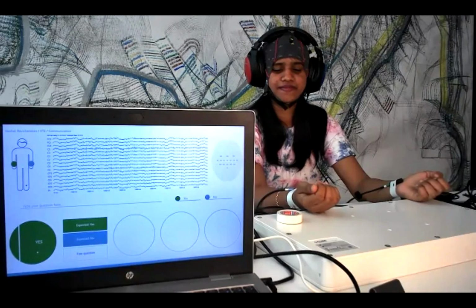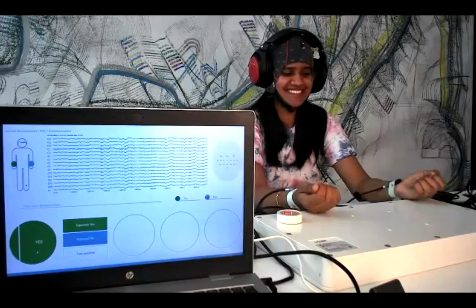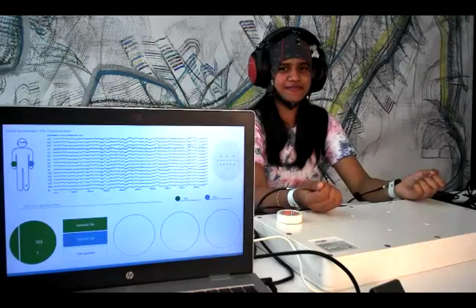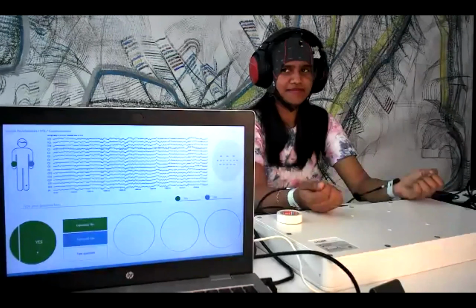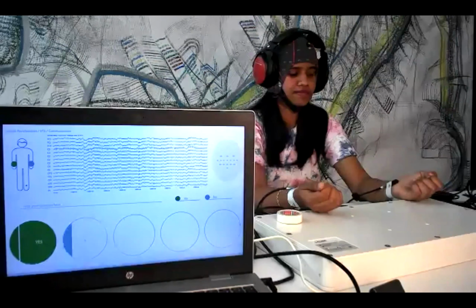So we can try, for example, a no question. So for example, I'm speaking Chinese. We'll see how it looks. So this time, if it's no, then you should count on the left. Okay, so you're ready? Let's count on the left. Let's go.